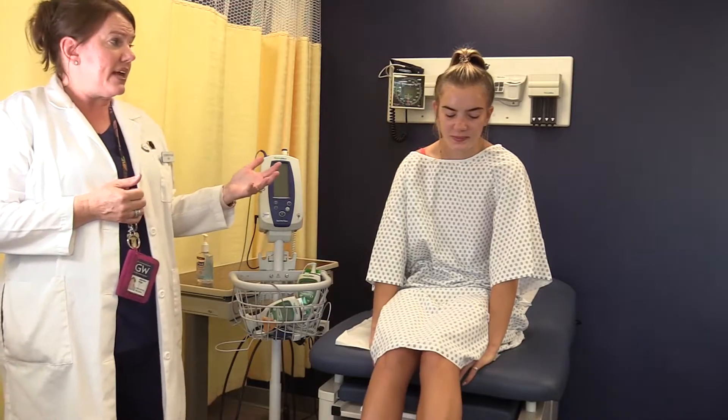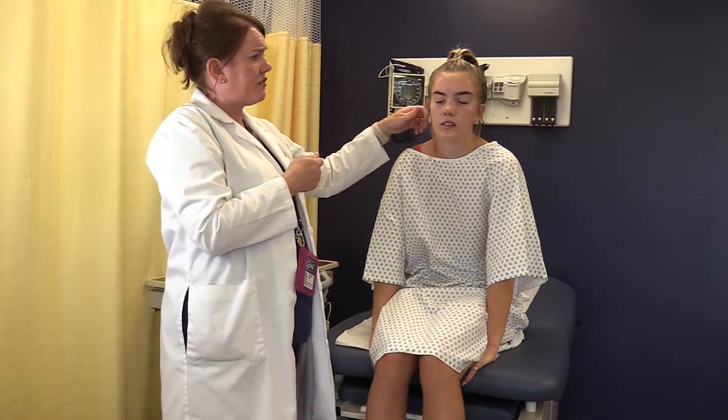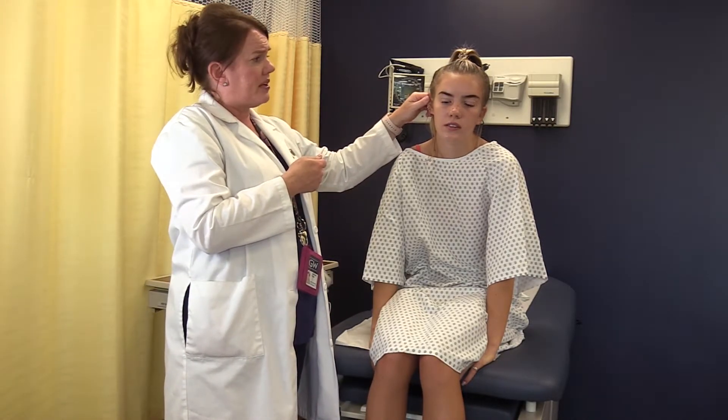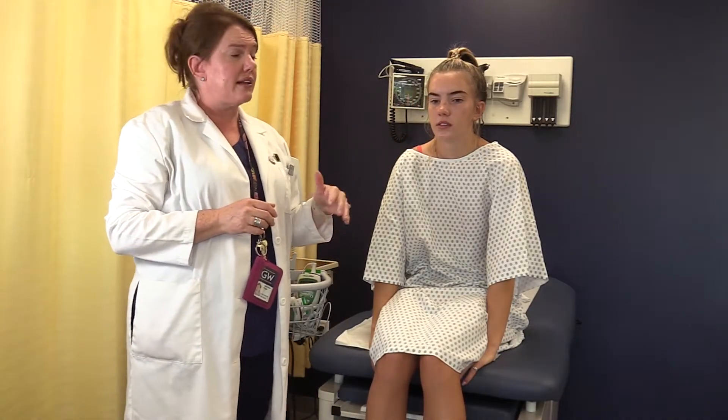Tympanic is the ear route, and these are very, very common — especially in surgery — and we're seeing them used a lot in all different facilities as well. You want to make sure you get a really good snug fit. For adults, you're going to pull the pinna up and back to get a good seal. For kids, it's down and back to get a good seal. This is the most reliable if done correctly, because the tympanic membrane shares the same blood supply as the hypothalamus, so it will be the closest to your core body temperature. But user error is a concern — you want to make sure you've got a really tight seal to get that correct tympanic measurement.